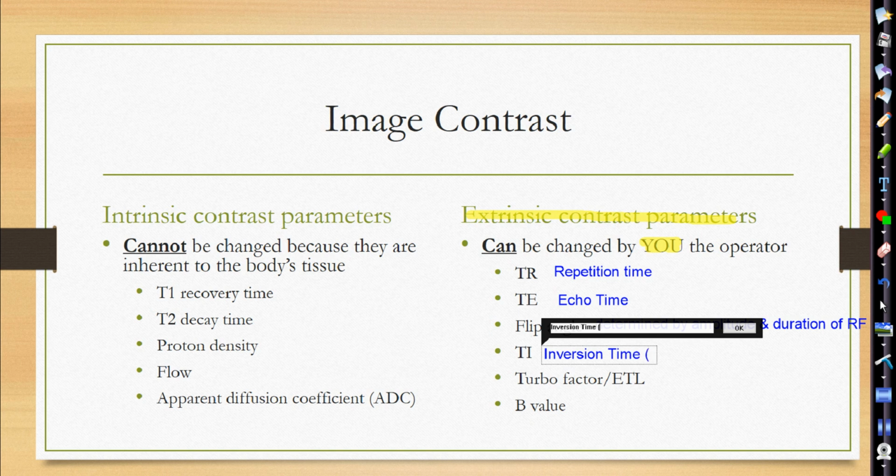This usually gives us our STIR sequence, which stands for short tau inversion recovery, or our FLAIR sequence. Anybody hear those words while you were in clinic? Yeah, STIR and FLAIR. FLAIR stands for fluid attenuating inversion recovery. FL is fluid, A is attenuating, IR inversion recovery. STIR, short tau inversion recovery.